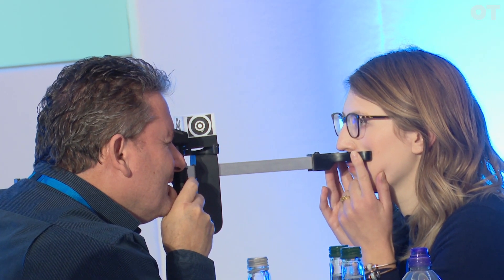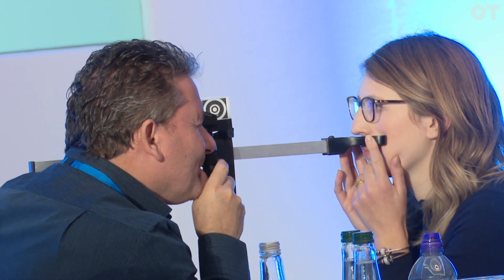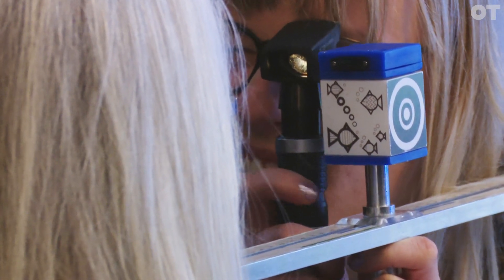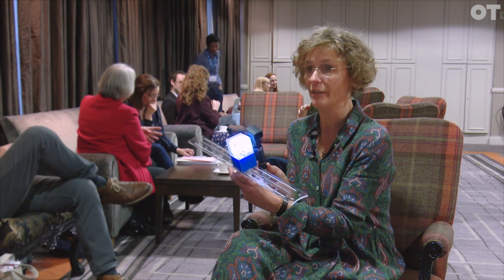You're setting this at a certain distance and you want to see if the child is focusing at that distance. It means that I can measure exactly where the child's eyes are focusing while they're looking at the target - so they might be telling me about the fish and that they're blowing bubbles and that one's got zigzags on and one's stripy, and I can look with my retinoscope and decide, without them having to tell me anything, where they're focused.